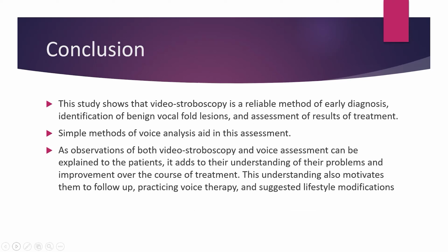So this study shows that video stroboscopy is a reliable method of early diagnosis, identification of benign vocal fold lesions, and assessment of the results of the treatment. Simple methods of voice analysis help in the assessment. The observations of both video stroboscopy and voice assessment can be explained to the patients. It helps in the understanding of their issues and improvement over the course of treatment. This understanding also helps them to follow up, practice the voice therapy, and make lifestyle changes. Next slide, please.